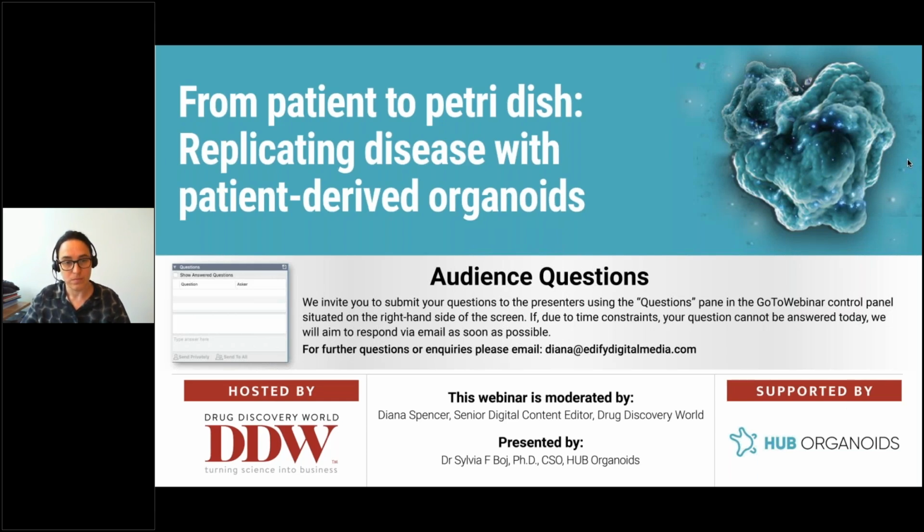Great, okay. Our next question, I imagine there's quite a lot that can be said on this, but you might have to just give an overview. So the question is, can you elaborate on the advantages of organoids in comparison to primary cells and co-cultures? So the difference with primary cells is that normally in the current situation, the primary cells directly from patients are available to perform one experiment, and that's all.